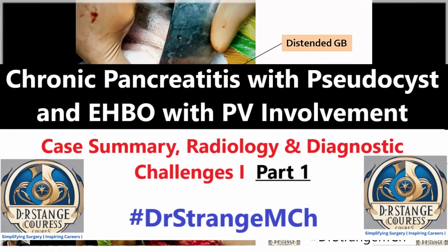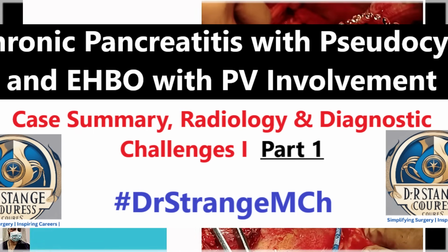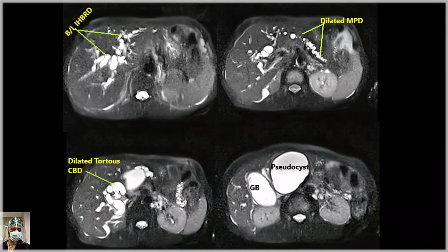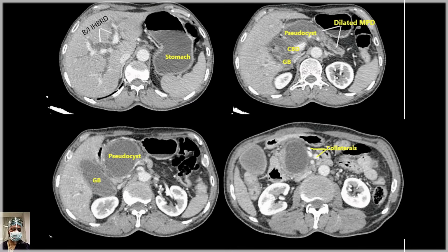As I said, the main highlights will be the pseudocyst replacing the head of pancreas, the portal vein coursing through the pseudocyst, and V-shaped excavation of the pancreas, that is the Izbicki procedure, which we will try to demonstrate through this video tutorial. In the second part of this video, we have demonstrated the live surgery and how after opening the pseudocyst, there was a gush of fluid which came under pressure, and how we managed this patient and what are the other surgical options in case of cystic lesion of pancreas, that we will demonstrate in the second part.